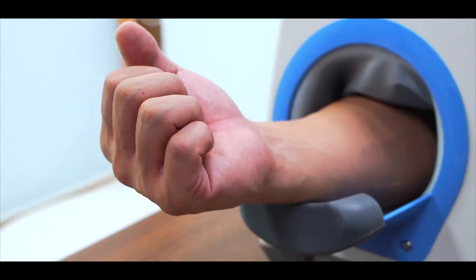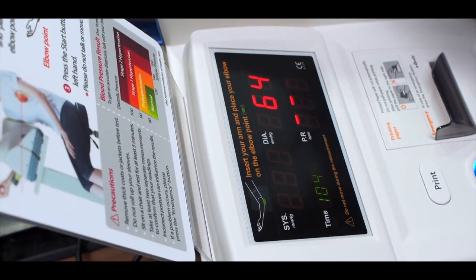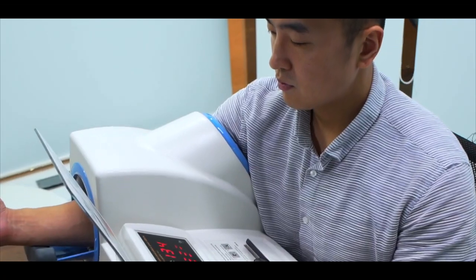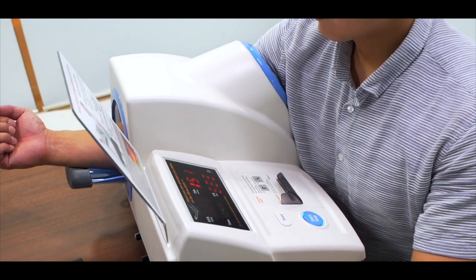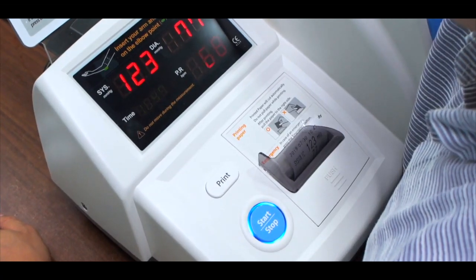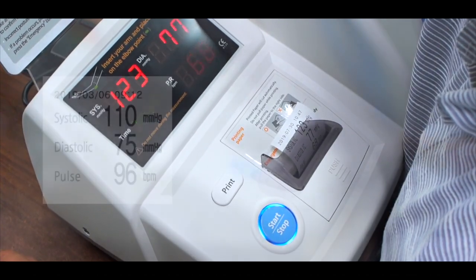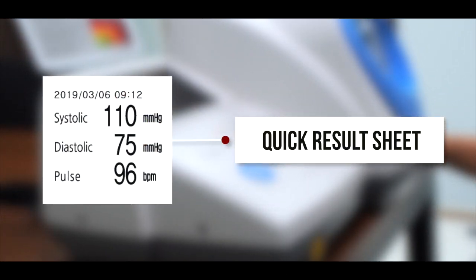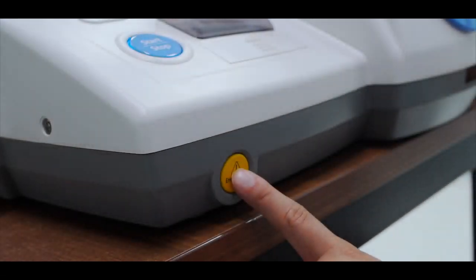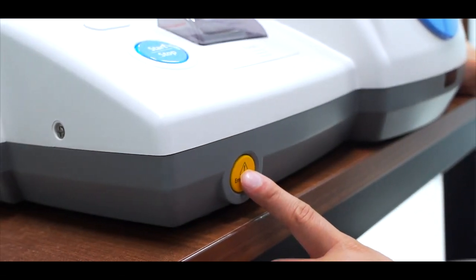During the test, please do not talk or move. Now you can see the systolic, diastolic, and pulse readings. If a problem occurs, please press the emergency button.